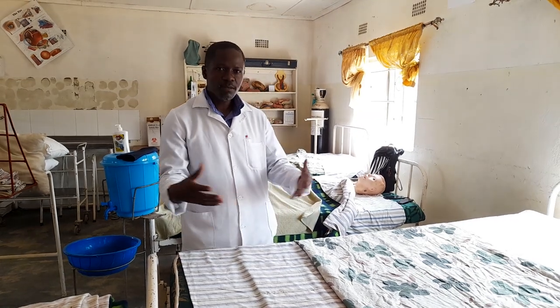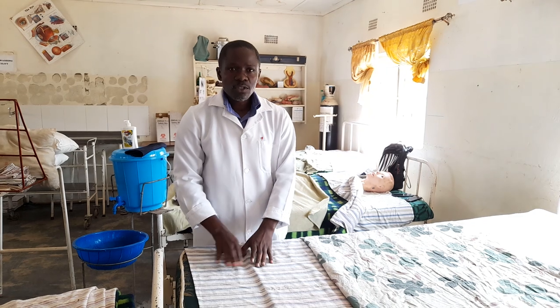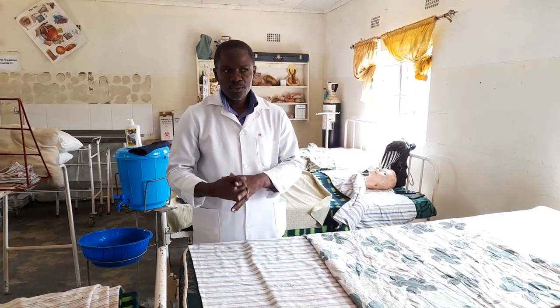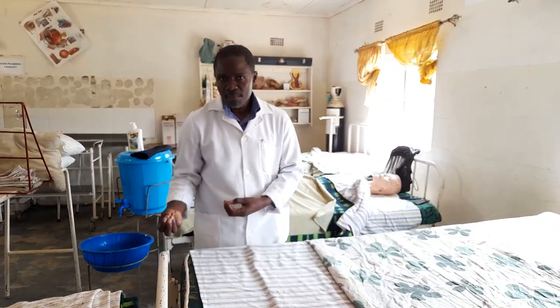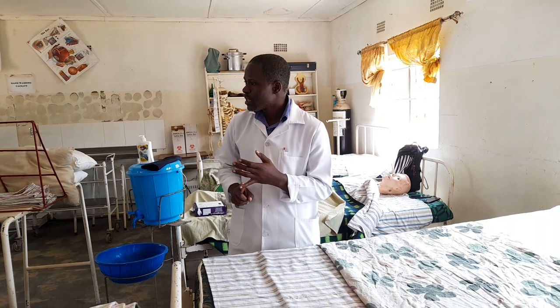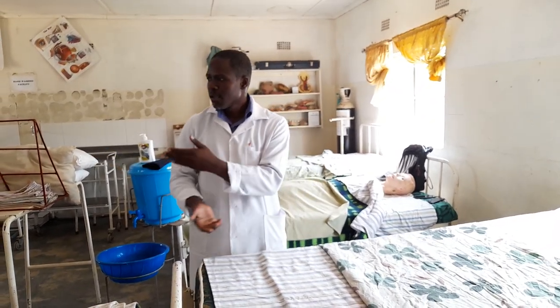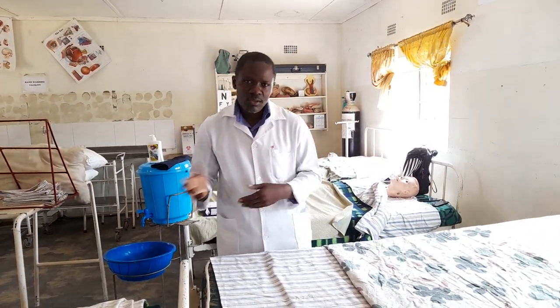Good morning. We're continuing with the same type of foundation, but the specific bed we're making is called a cardiac bed. If you're doing a cardiac bed, you need to look out for the indications. We make this bed because the patient is dyspneic or has a respiratory condition — they become restless lying flat, so we need to prop them up so the patient is comfortable and able to breathe properly.